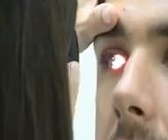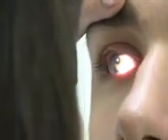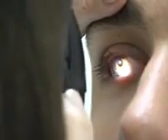So let's just try that. We're going to get close to our patient. We're going to brace carefully. Right hand and right eye for the patient's right eye. Get your light in the patient's pupil. See the red reflex. Start to dial down and move closer until you see a vessel.